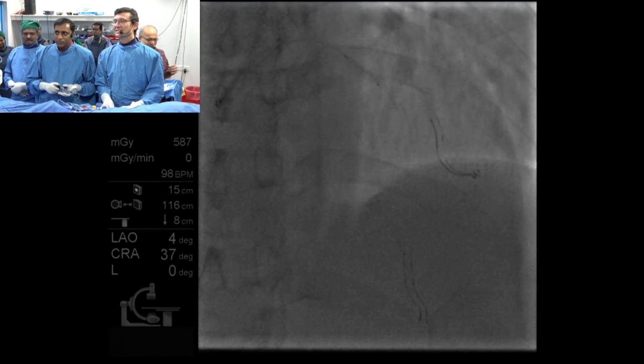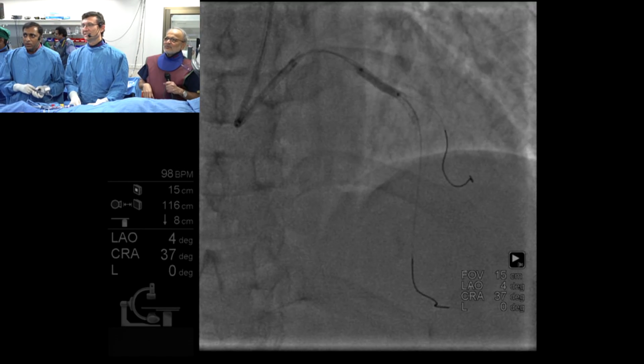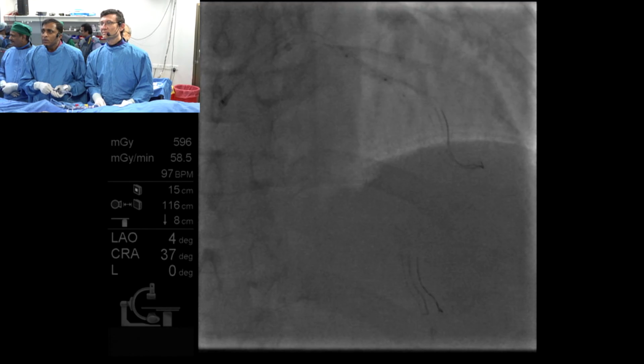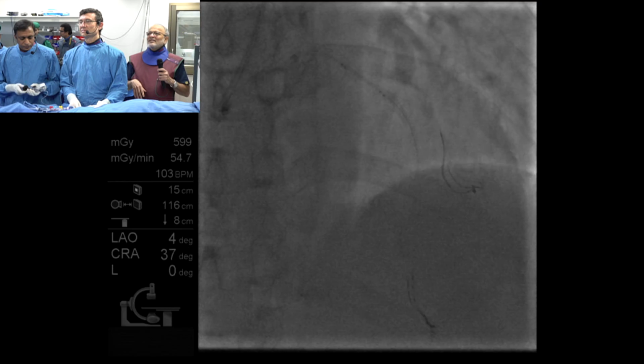Tak, do you use 2 millimeter in your Chinese population who come to you? The Chinese population, yes. Are you using 2 millimeter just like Indian artery? No, I think our artery is a little bit bigger. A little bigger, huh? I like that. Not as big as, I mean, Maurice.